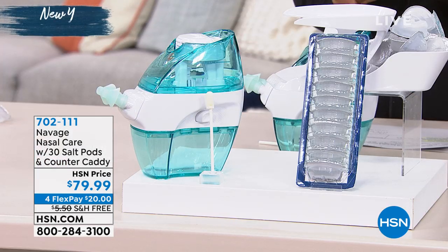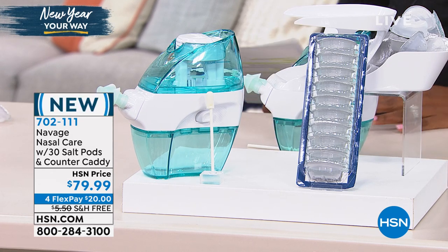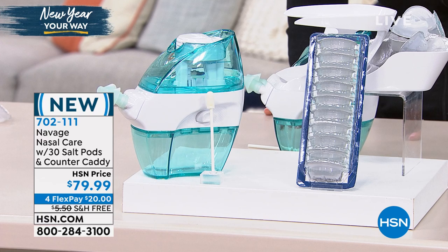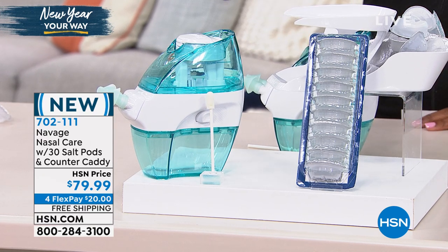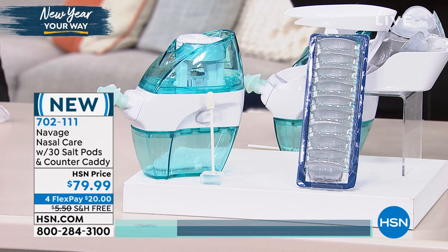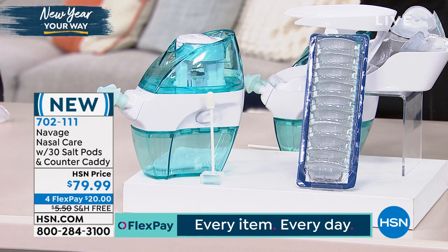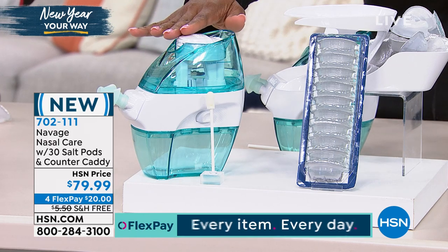Every season — maybe in particular cold and flu season, allergy season — your sinuses talk to you and they don't have nice things to say. That's where Navage comes in. This is nasal care. This is a system that helps to clean and moisturize your nasal cavity, and what's great is that it's simple and easy to do. You get everything you need, and it's not intimidating in any way.